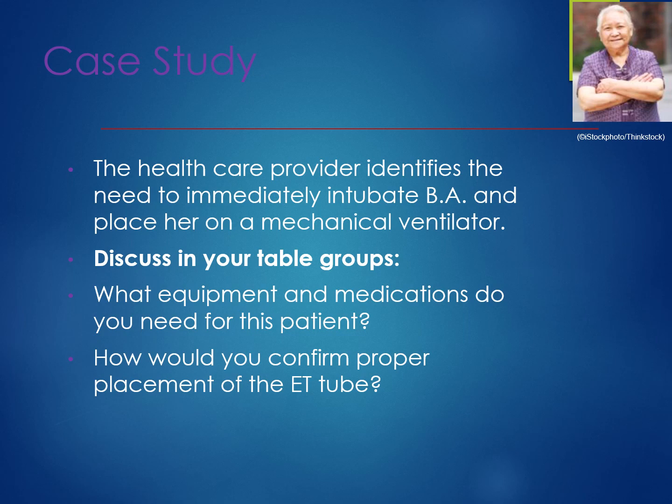The laryngoscope is like a little camera that the physician will use to actually intubate the patient, and only physicians are allowed to intubate the patients. The nurses don't do this. Paramedics are able to, but they use a special type of equipment to do it. We want to make sure that we have a bag valve mask with 100% oxygen to make sure that we're giving them 100% oxygen prior to the intubation.